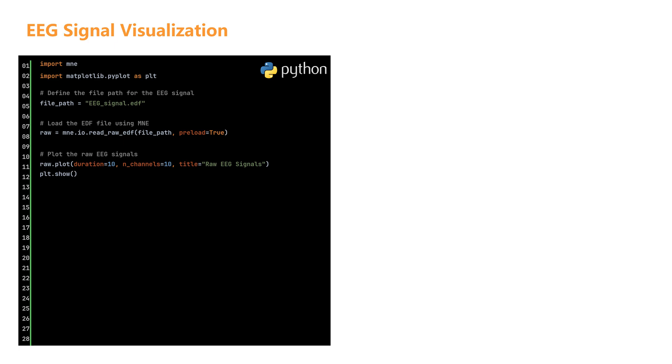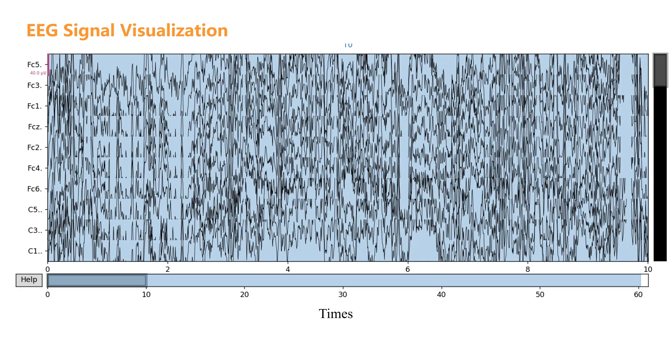When loading large datasets, releasing resources is a good practice. We can close the data stream using the following code. Now let's run the code and observe the EEG signal waveforms. This method allows us to quickly explore and analyze the data.